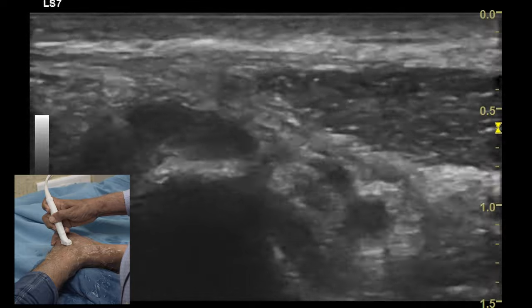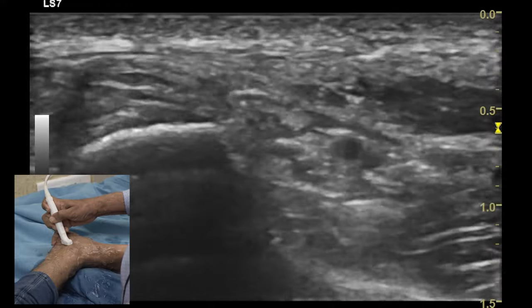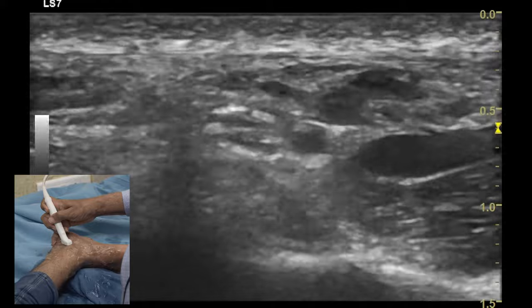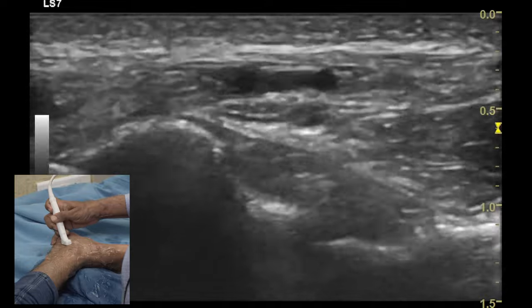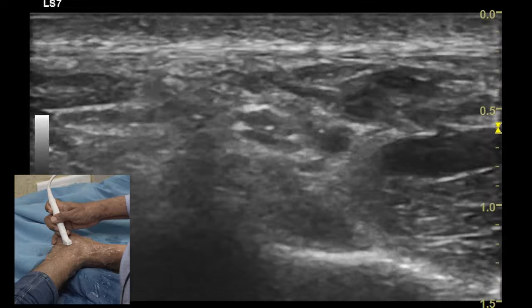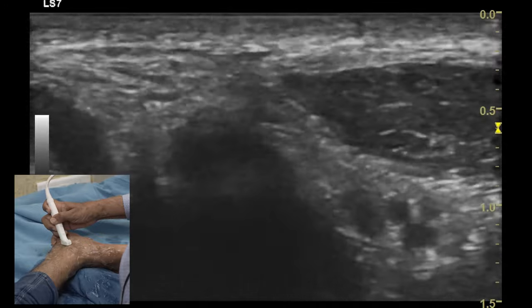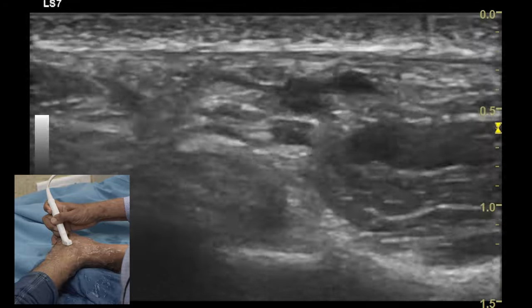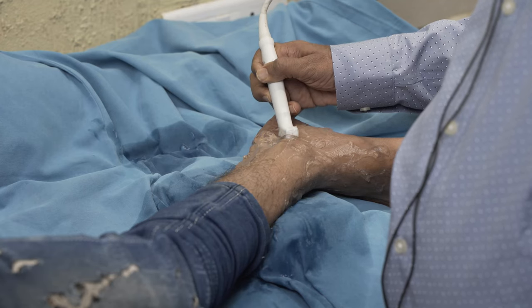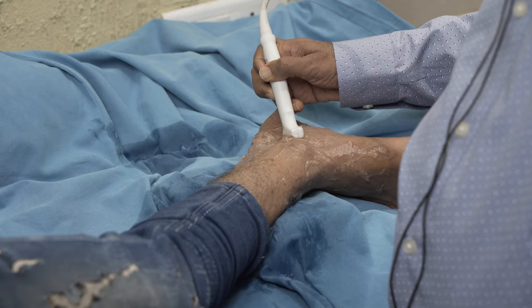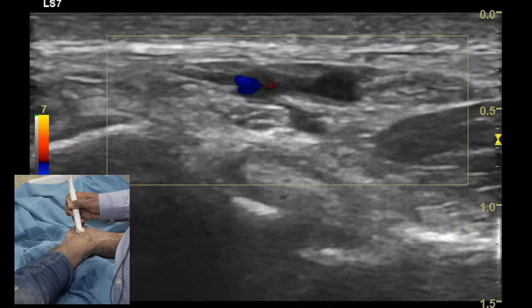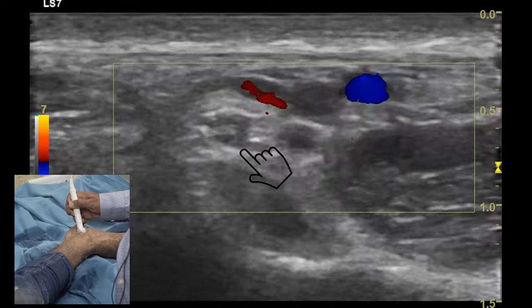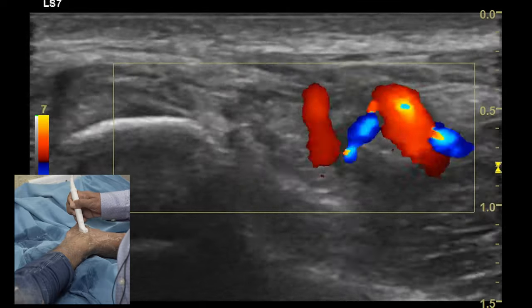Between the tendons of the flexor digitorum longus and the flexor hallucis longus, one can identify the neurovascular structure, which is made up of two veins (the posterior tibial veins), one artery (the posterior tibial artery), and the posterior tibial nerve. The mnemonic commonly used to identify and remember the order of these structures is Tom, Dick and Very Very Nervous Harry, which represents the order in which the structures are visualized in the posteromedial aspect of the ankle joint.